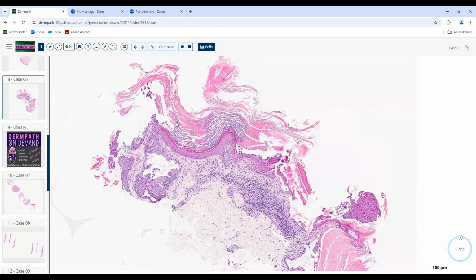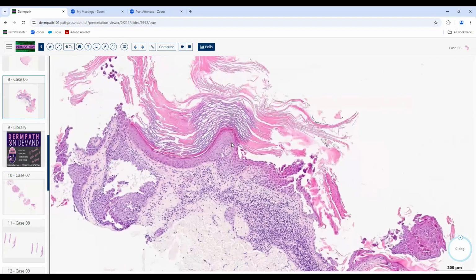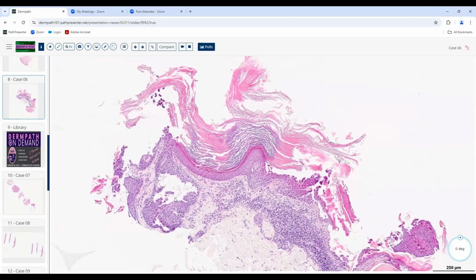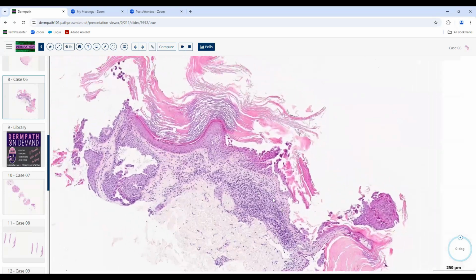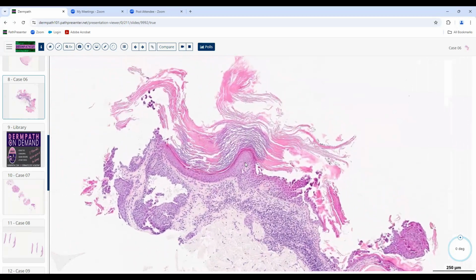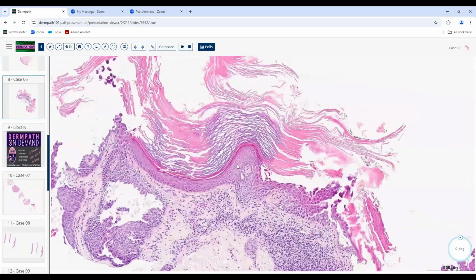It's the closest thing that we had to it because we never see a case of this. This patient came in with multiple papules. I think they're mostly on the legs and maybe some on the trunk. They did a biopsy and it showed these church spire verrucous hyperplastic areas, which is what you're supposed to see with that, coupled with this parakeratosis. The acantholysis is not really a classic finding of that, so I'm not sure I would use this as a great example of it, but we just wanted to show you something that would fit into that general category.